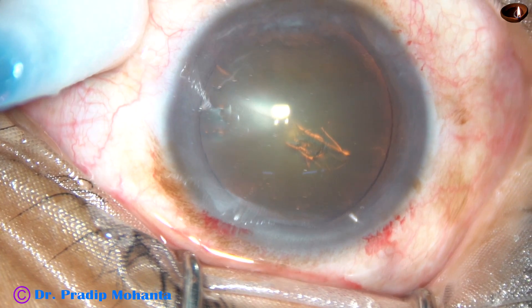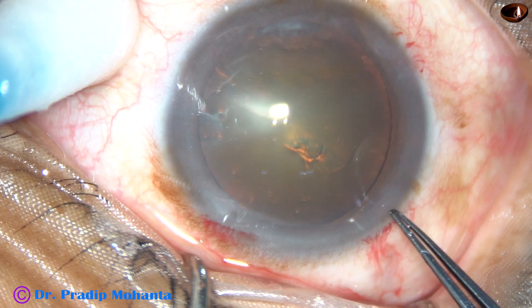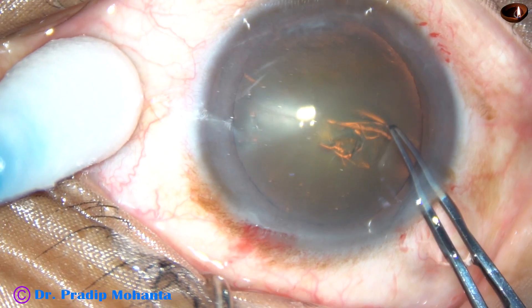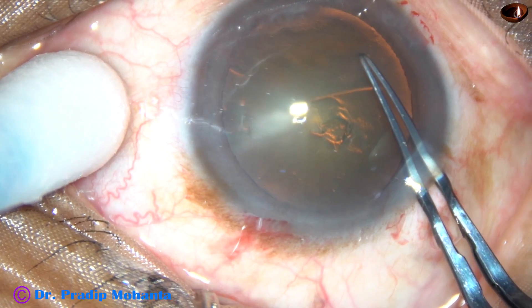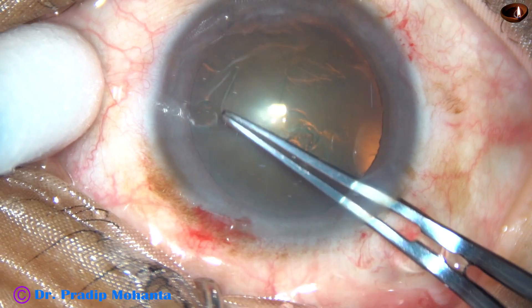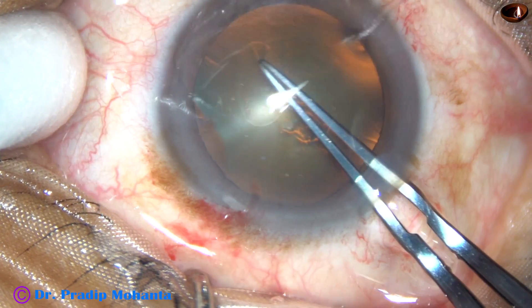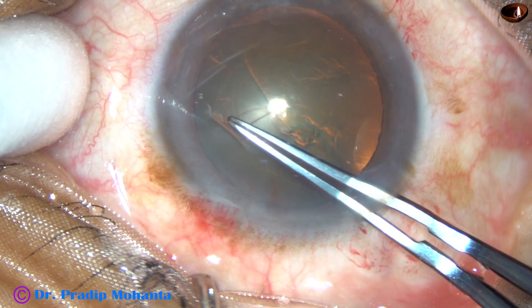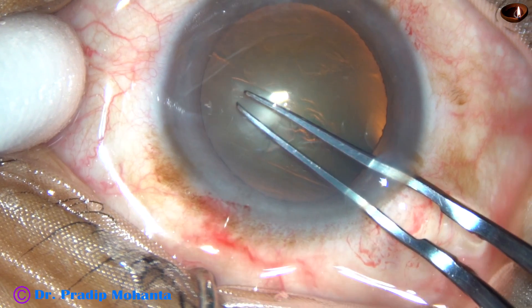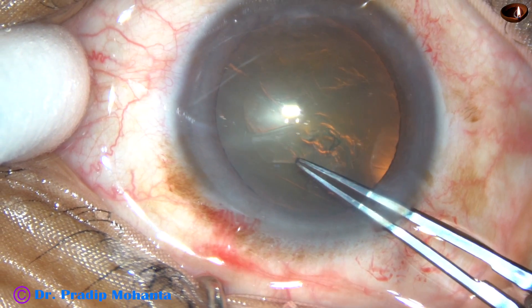Incise the capsule and raise a flap. Now introduce the utarata and lift the anterior lip of the main incision. Keeping the anterior lip lifted, move the utarata all around and do the rhexis. Remain at a certain distance away from the margin of the dilated pupil.